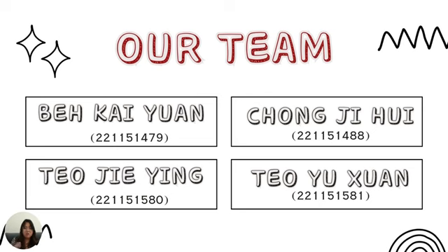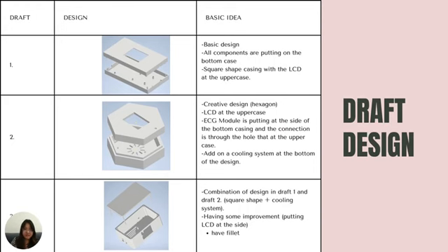Now I'm going to discuss my part, where I'm responsible for the draft designing. As you can see, here is a table which summarizes our three designs in one table, and there is an evolution and improvements from draft 1 to draft 3. So let's discuss it. Draft 1 is a basic square shape design with the LCD at the upper case and all components put on the bottom case.